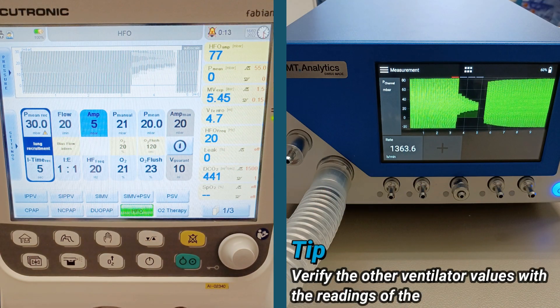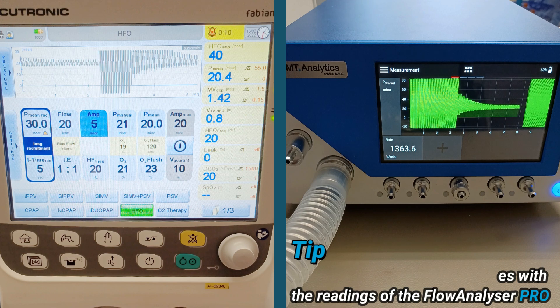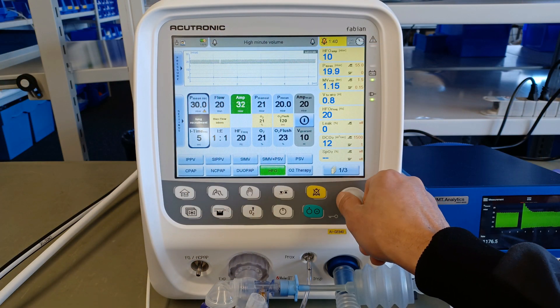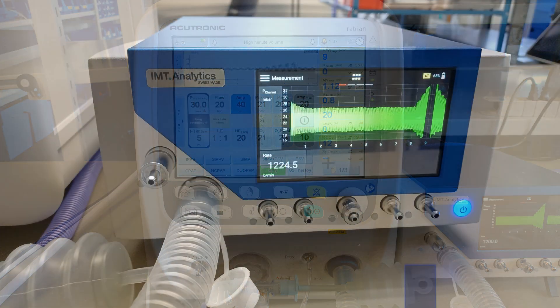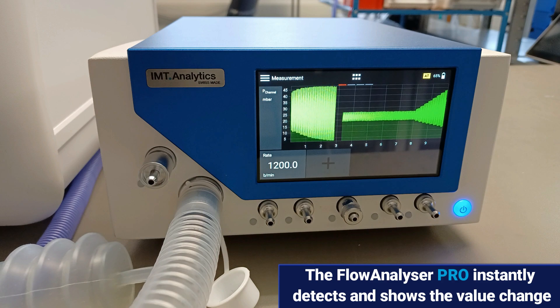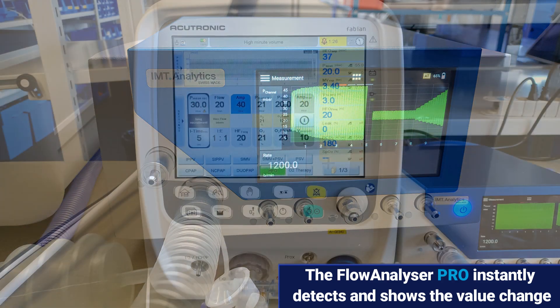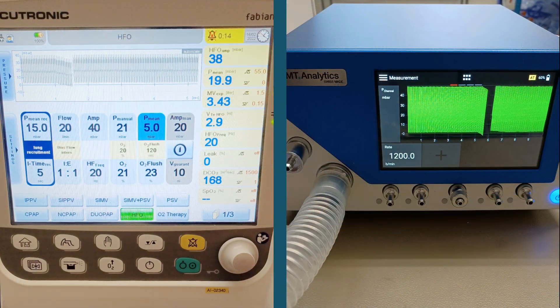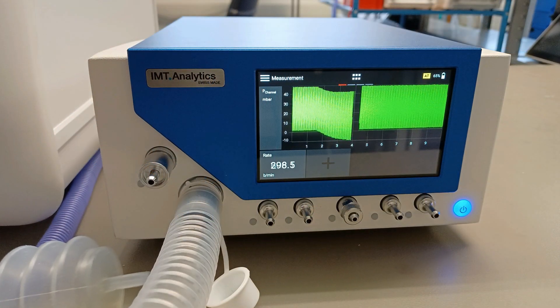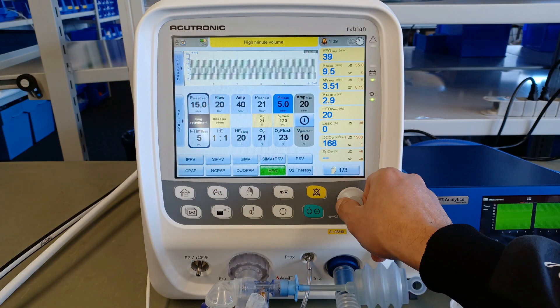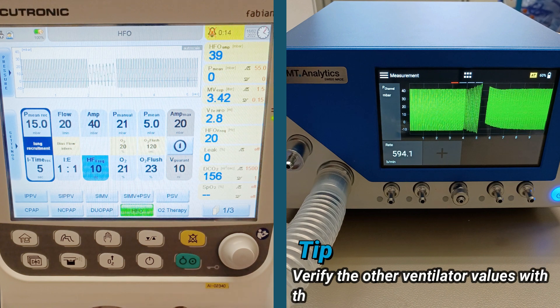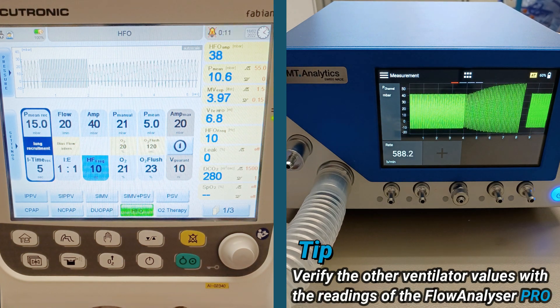Verify the other ventilator values with the readings of the Flow Analyzer Pro. The Flow Analyzer Pro instantly detects and shows the value change. Verify the other ventilator values with the readings of the Flow Analyzer Pro.